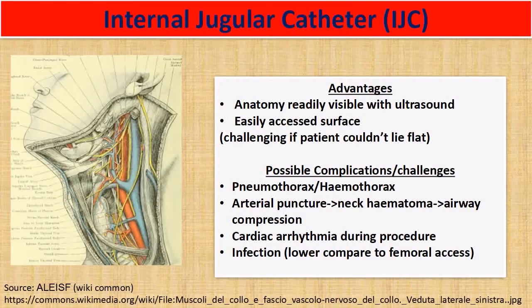Also, the patient may be at risk of cardiac arrhythmia during the procedure, because if the guide wire were to be inserted too deeply, it may irritate the ventricles, triggering ventricular arrhythmias. And the last consideration will be the risk of infections, just like any other procedure.